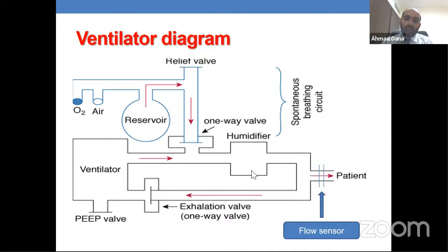Either the ventilator itself, or there is, let us say, tube disconnection before the baby, before the flow sensor. Okay? So this is one aspect. Now, you are achieving the pressure, but let's say that there is a problem with the flow. So it is related to the patient himself.